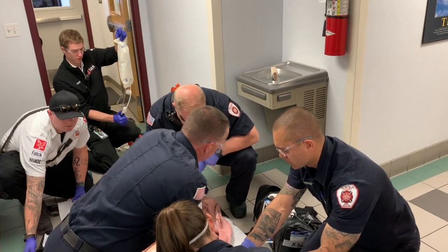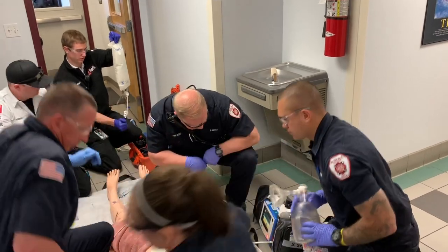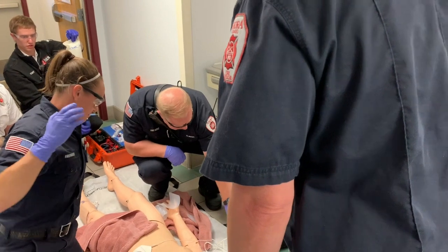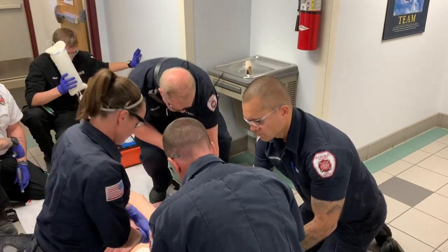Okay, I'm going to go ahead and charge. Coming on out with 150. Charging. Okay, everyone clear the patient. I've got the fib. I'm clear, you're clear, everyone's clear. Shocking. Okay, resume CPR.